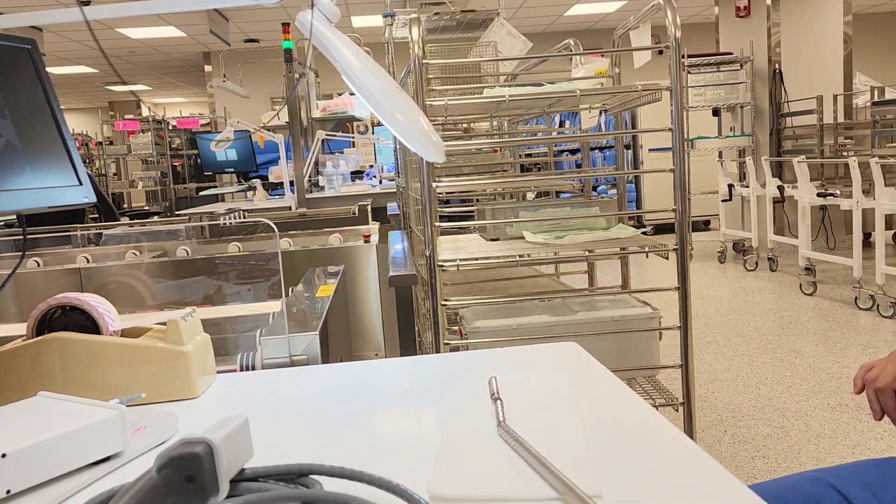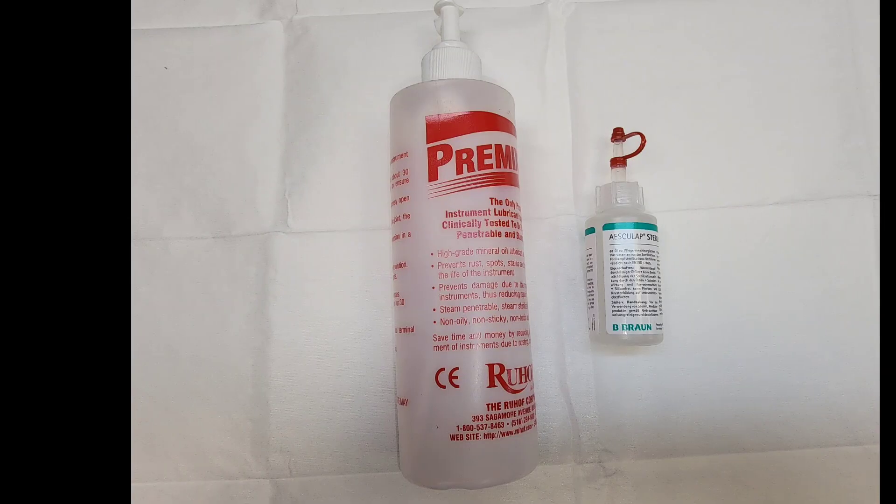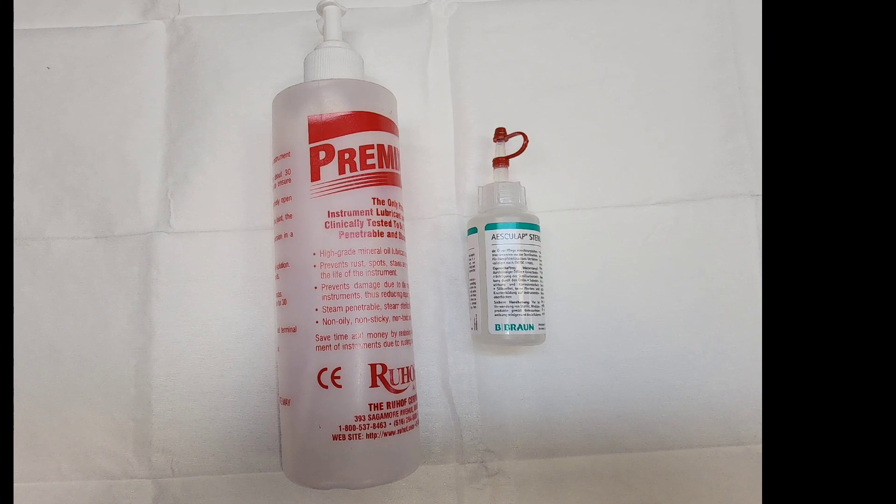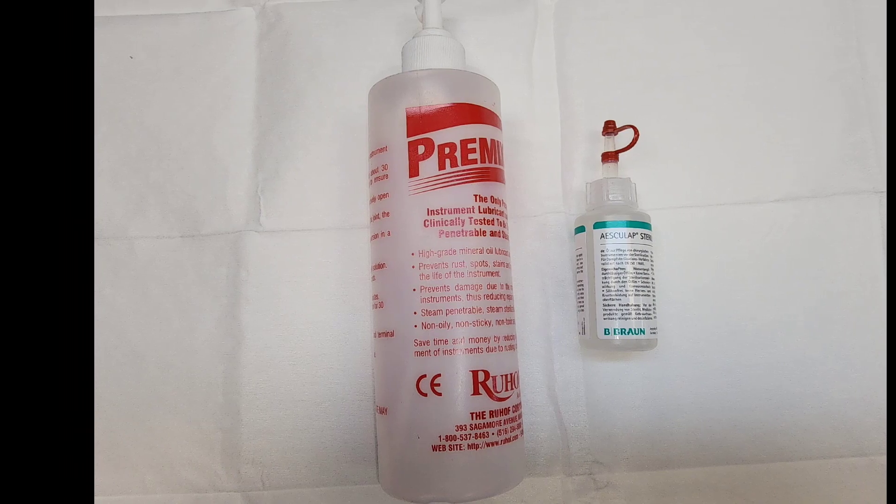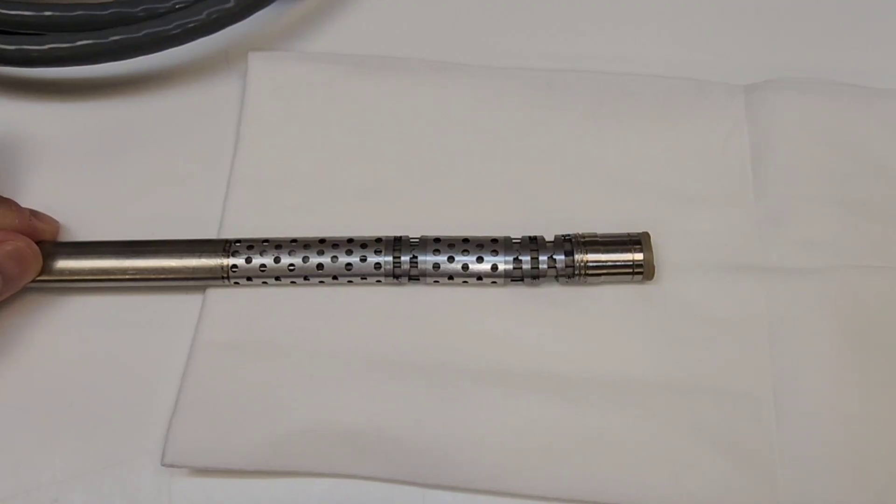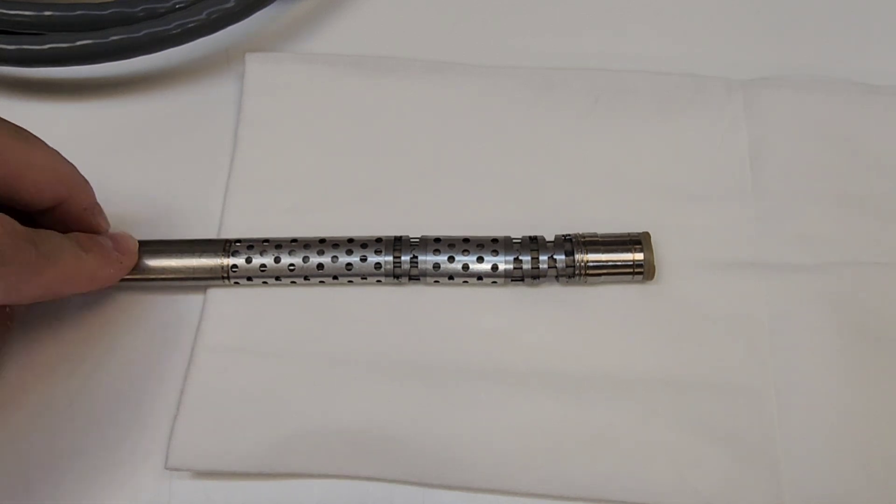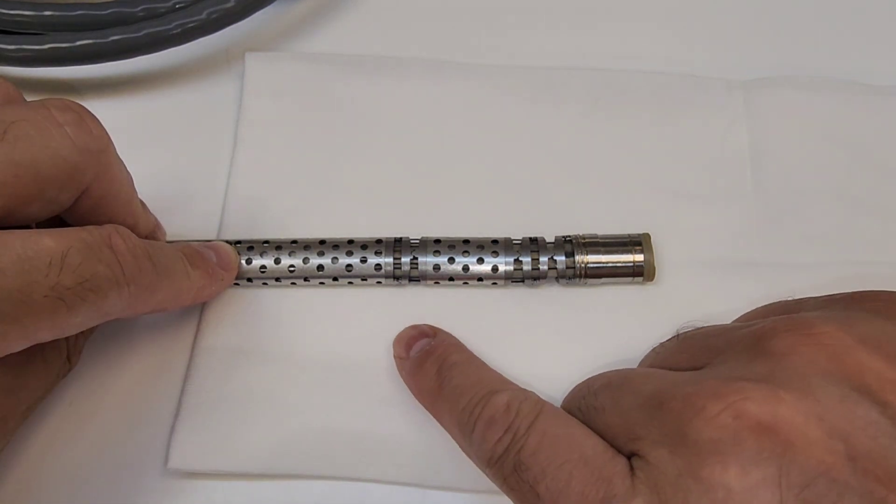After inspection, everything looks nice and clean. What is next? It's lubrication of the tip. Make sure the brand you have is able to withstand the sterilization process of steam sterilization and that it can be penetrable. This is the distal tip of the device. There are certain points that need to be lubricated, and there's six of them all together.